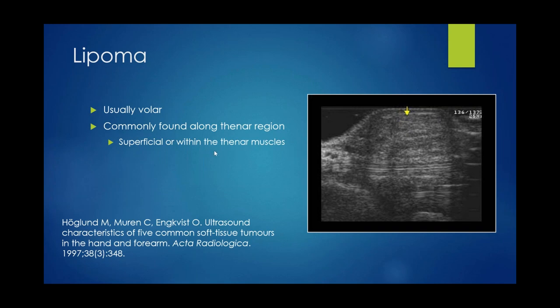Which direction do you ultrasound when evaluating for a possible glomus tumor? I showed mostly one projection for evaluating structures, as some structures are more amenable to interrogating in their short axis. Some are more easily seen in their long axis. So you would look at it in both axes. To me, the nail bed would make most sense if it was initially interrogated in its long axis. If I saw an abnormality, I would then also image it in its short axis or cross section.